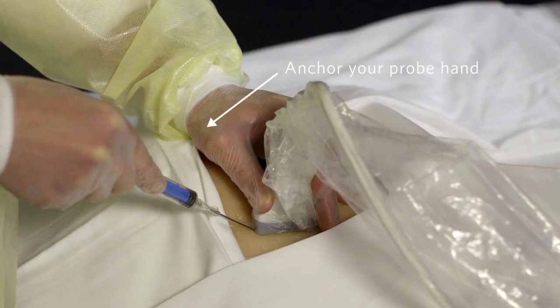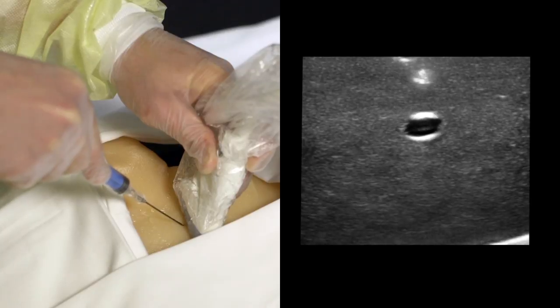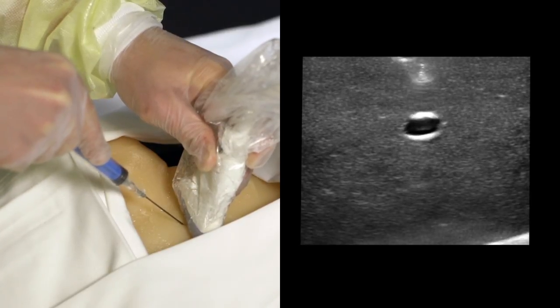Always anchor your probe hand on the patient to make sure your probe doesn't wander off target. This gives you tactile feedback that you are not moving the needle in relation to the patient. If the needle is not easily visualized, bounce the needle a bit as this movement will be easily seen on the ultrasound screen.